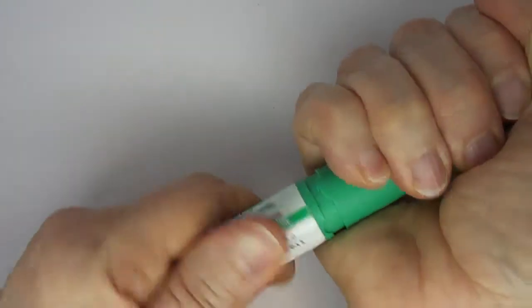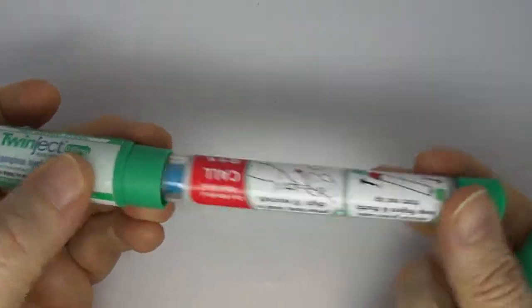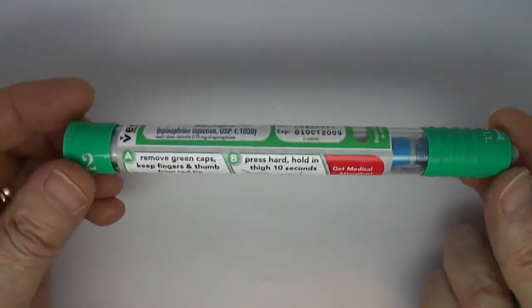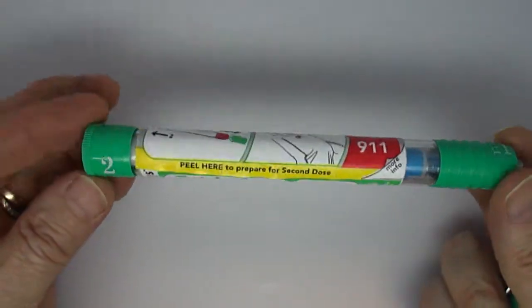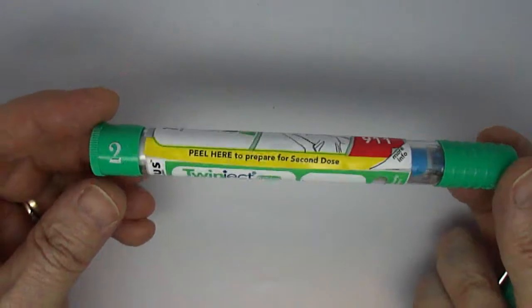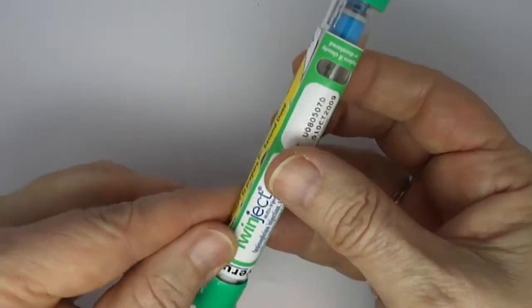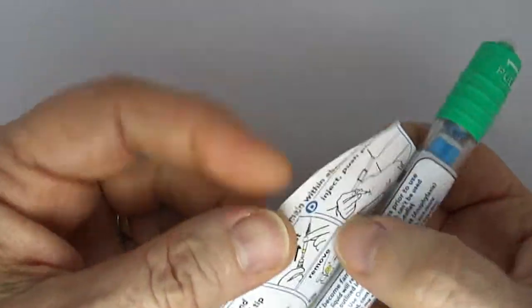Open this up and you can see it looks a lot like an Auvi-Q or a generic for Auvi-Q auto-injector. It has two caps and a label that you can open further and get more information.